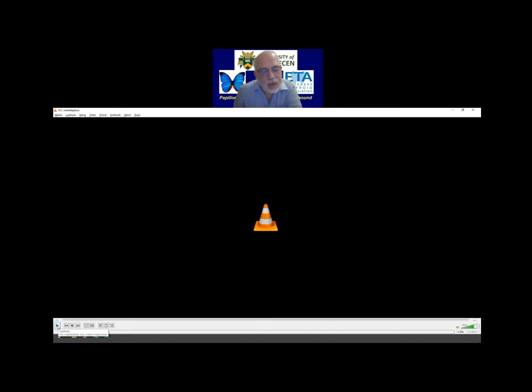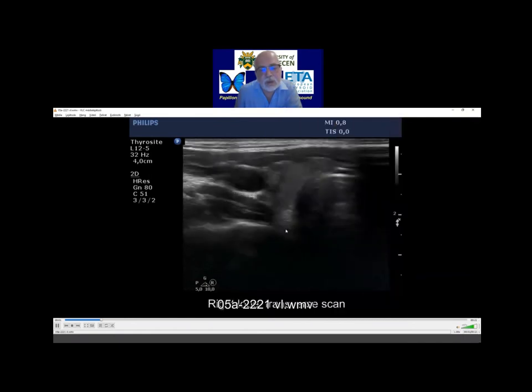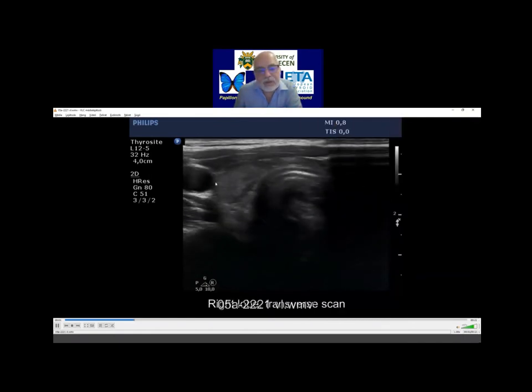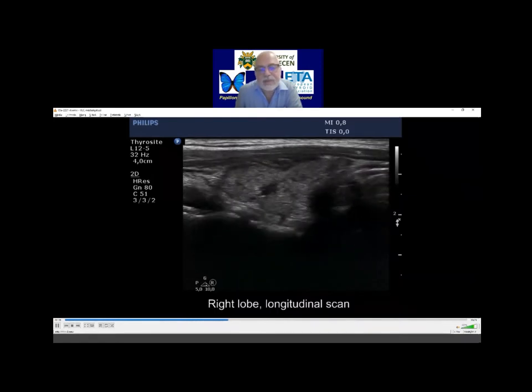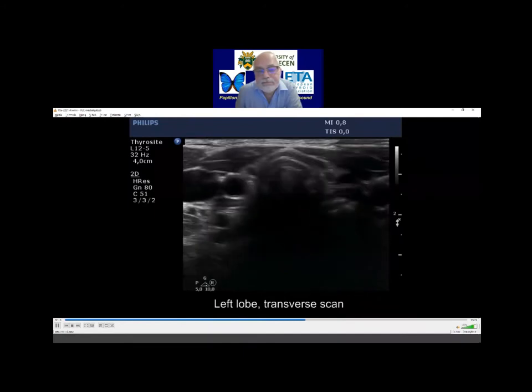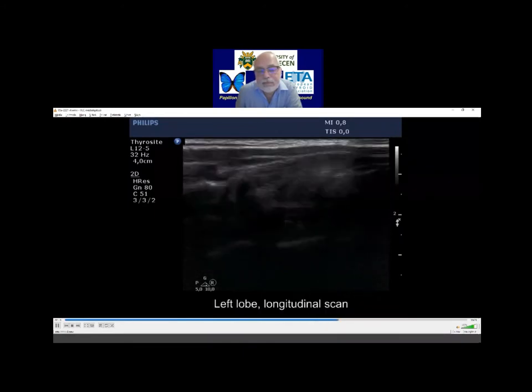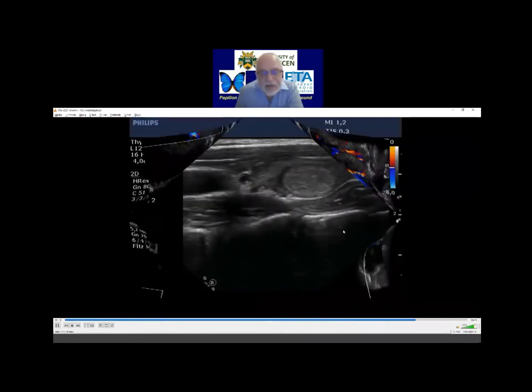I repeat once more, and I have a question. This patient should have two independent thyroid diseases simply viewing this video. The first is the nodule in the left lobe, and what is the other disease which this patient must have? Any ideas? Thyroiditis.